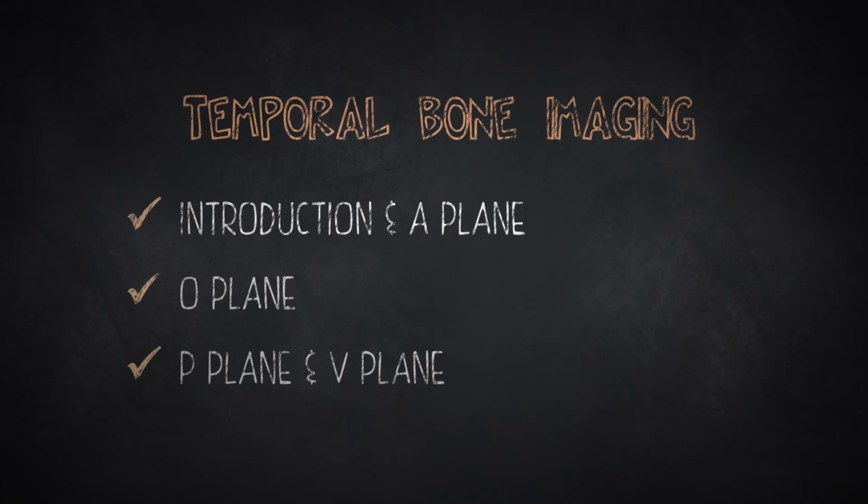And once we started doing computed tomography of the temporal bone in the late 70s, the transverse axial plane was imaged for the first time. So we needed to learn the anatomy in that plane, and I found it easier to go from top to bottom in the temporal bone.